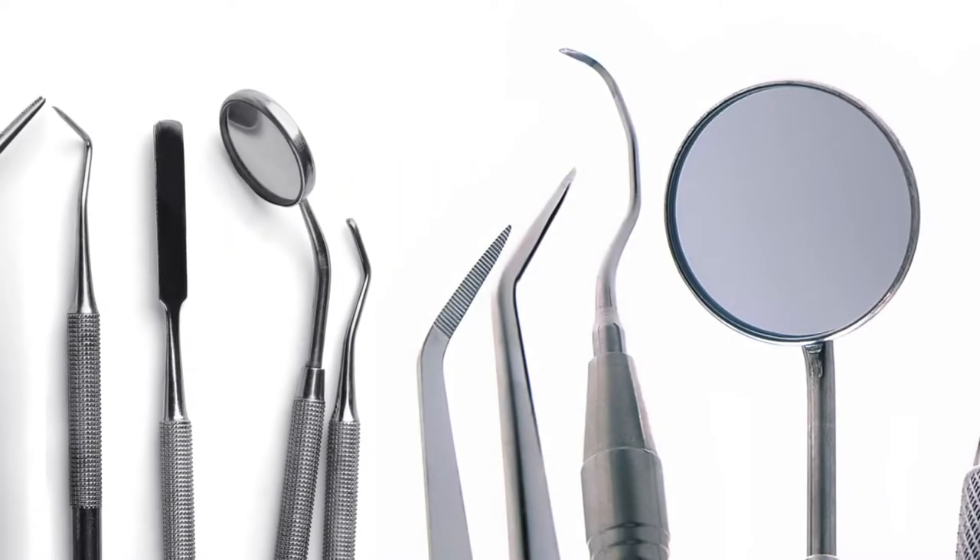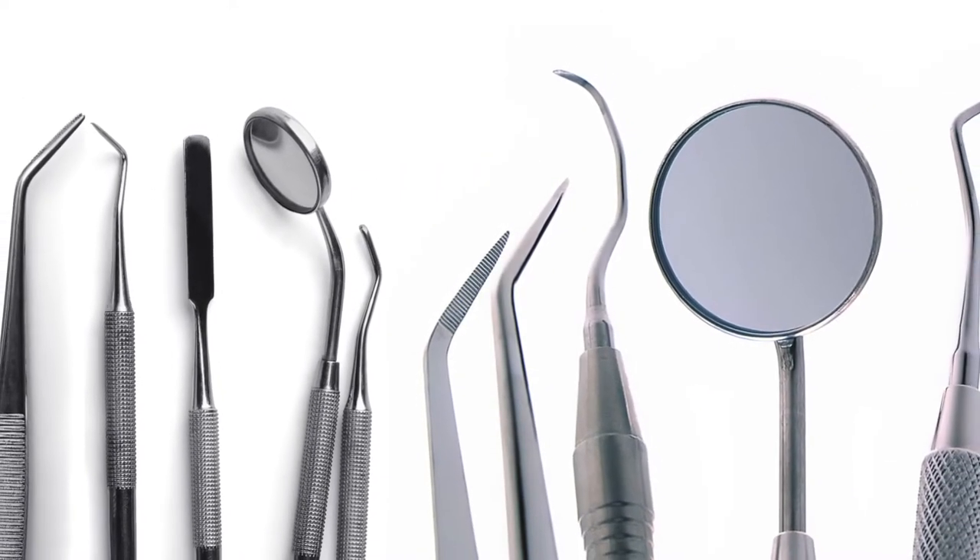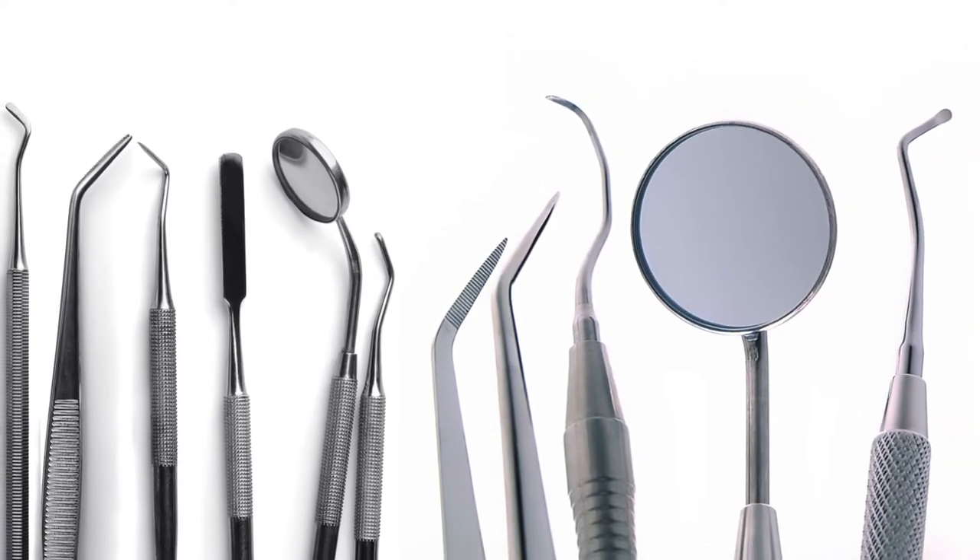When it comes to cleaning dental and medical instruments, you need a powerful solution that is designed to remove proteins, fats, and carbohydrates.